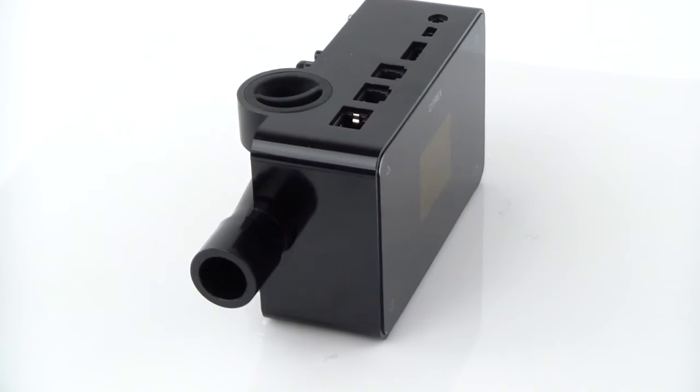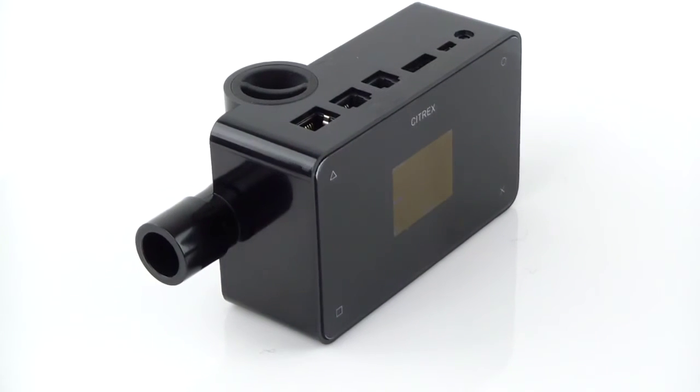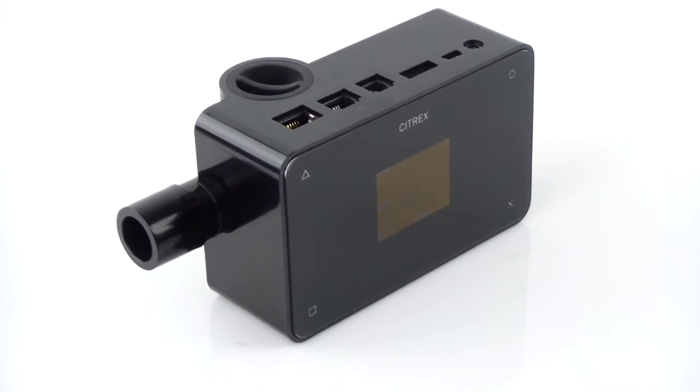The Citrex H4 is a compact and reliable ventilator tester, designed to verify and calibrate any kind of ventilators.